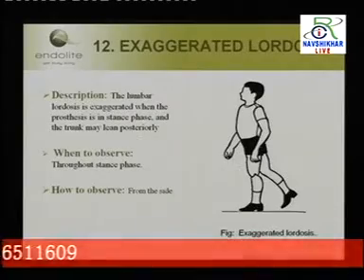Basically, he needs to stabilize the knee joint. If he doesn't stabilize the knee joint, it will result in buckling of the knee joint. So he does these trick movements because of a problem in either the stump, that is the patient cause, or the socket or the alignment, and we need to find out the exact cause. The best view to see this is the side view, because we have to see the C-shaped curvature of the spine. So with an incorrect curvature of the spine, we have an exaggerated lordosis problem.